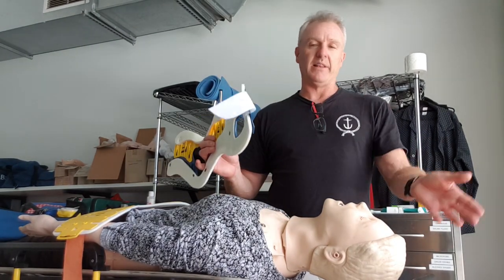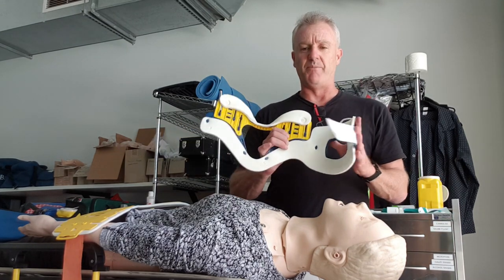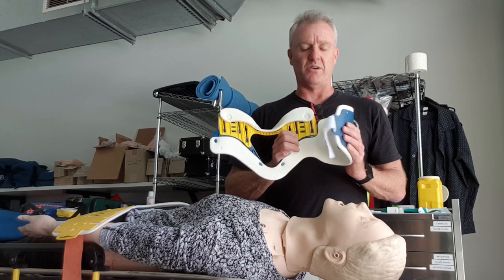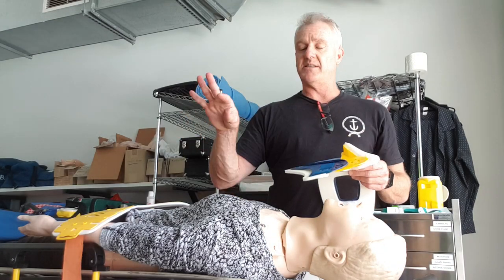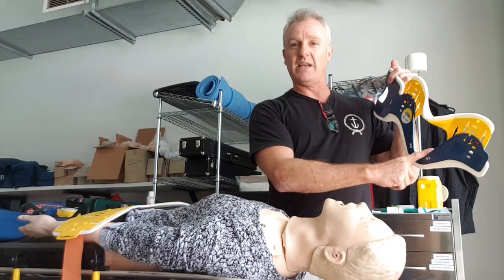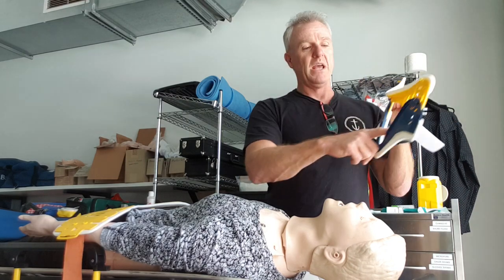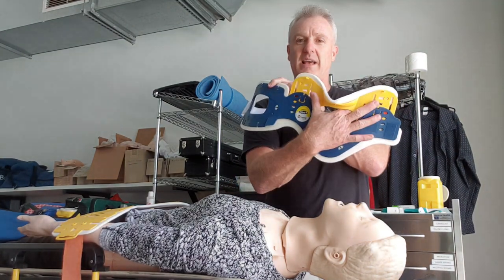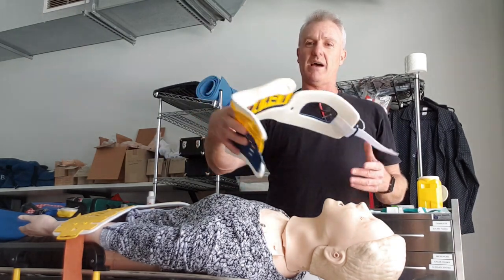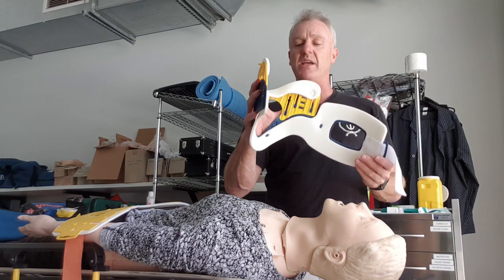When you go to apply the collar, let's take it for granted that someone's supporting my patient's C-spine. Give the back a little bit of a bend or mould it, so it goes on in the manner that it's designed to. I like to stick my index finger through the large hole, and my other three fingers around the front. I hold it almost like a puppet — that gives me control of the collar.